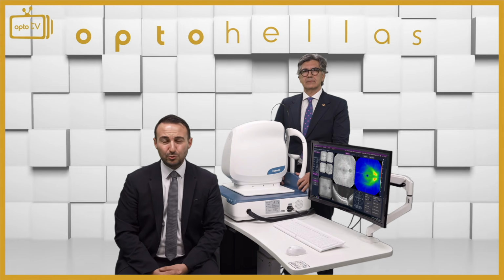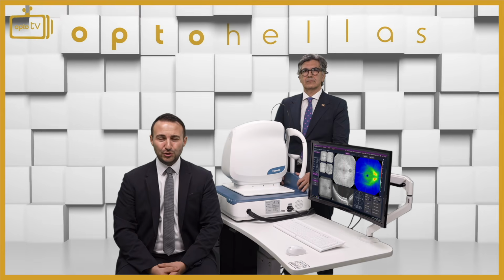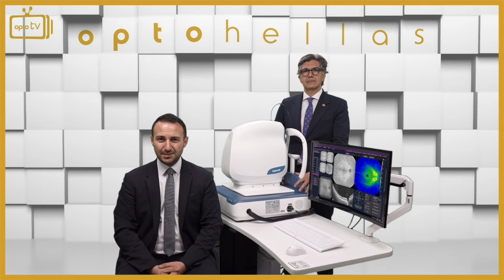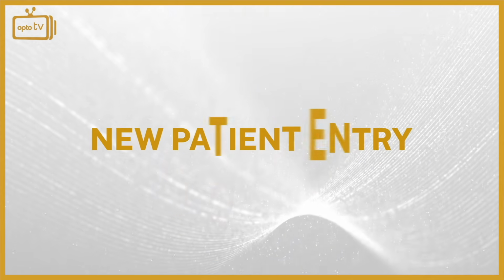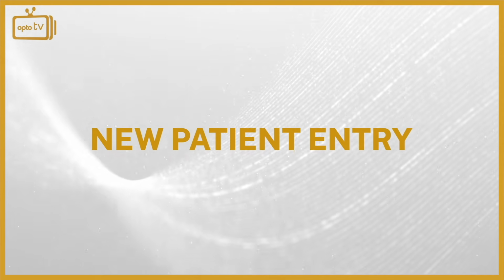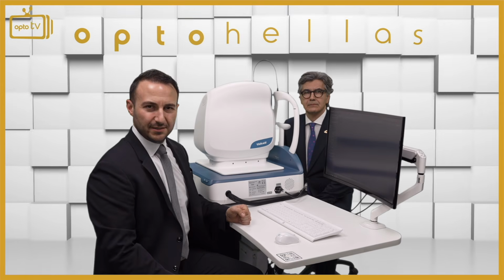We want to welcome you to the first video tutorial of the Yalkaid Swept Source Ultra-Wide Field OCTA manufactured by TowardPi. In the first chapter, we will showcase you the proper macula scan. The first thing we will show you is how to create a new patient entry.